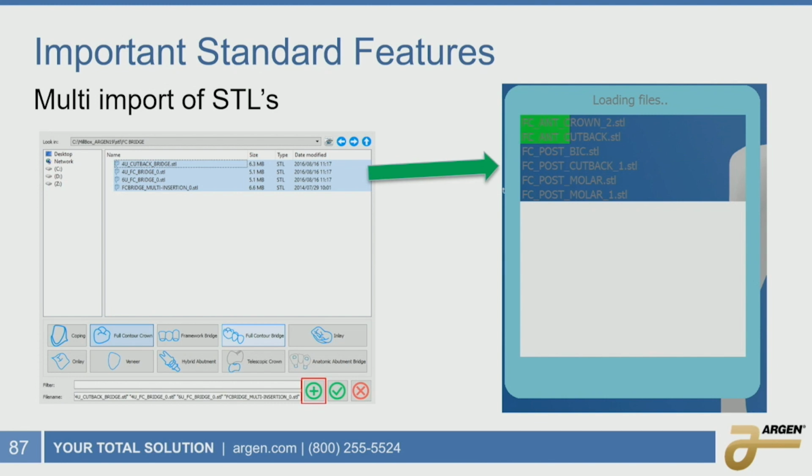So some of the new features that are coming out in Millbox, late last year they released what they called the Roland Standard Edition, which encompassed a lot of features from some add-on modules that Millbox had previously released. They released two add-on modules a long time ago, called either the Comfort add-on or Expert add-on, and each one had certain bells and whistles. In, I think, August of 2019, they merged the Comfort add-on module into the Roland Edition.